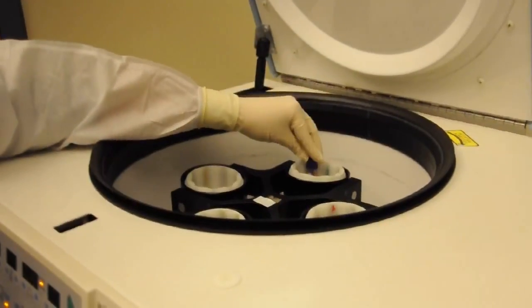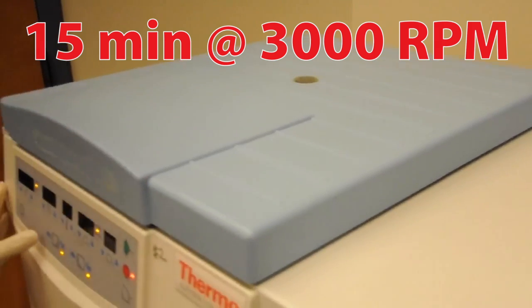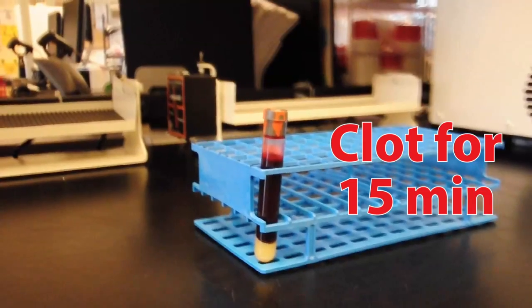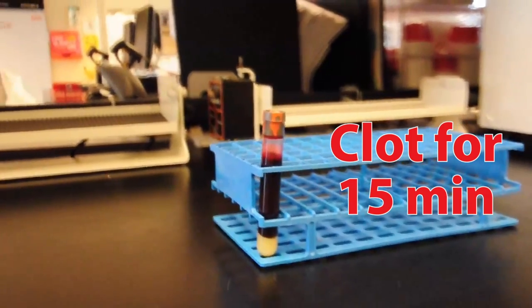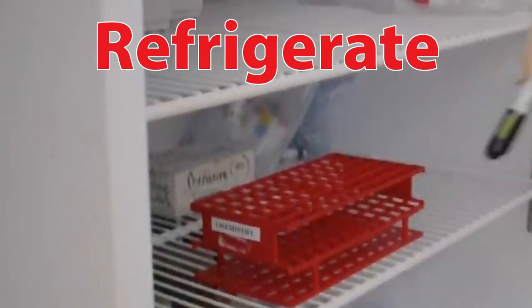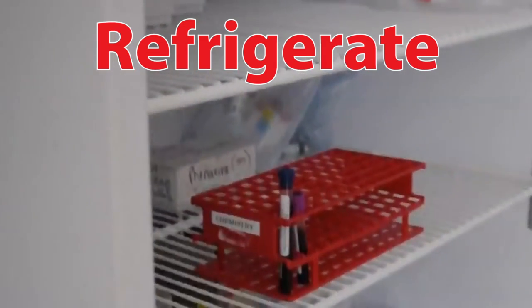Then centrifuge the blue top sodium heparin tube for 15 minutes at 3000 RPMs. Place the red Tiger Top SST tube in a tube rack, allowing it to clot for 15 minutes. Refrigerate the blue top sodium EDTA tube and the small lavender EDTA tube.